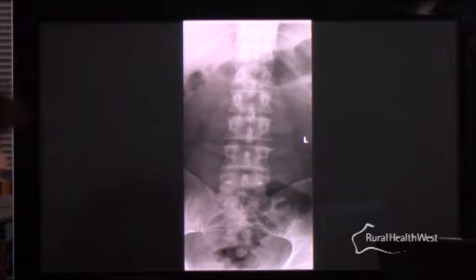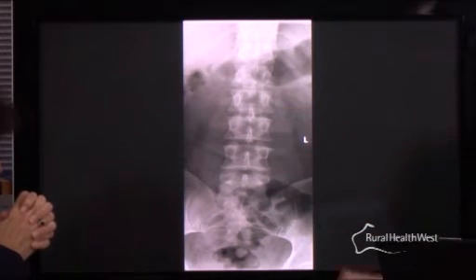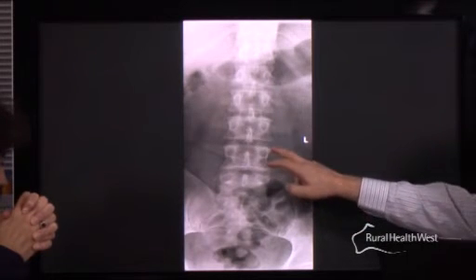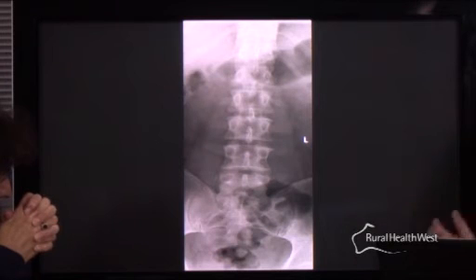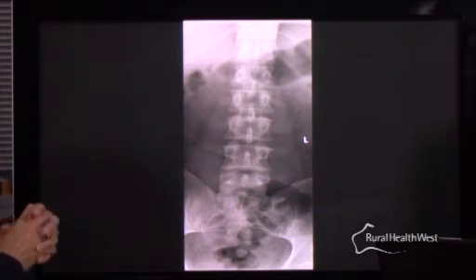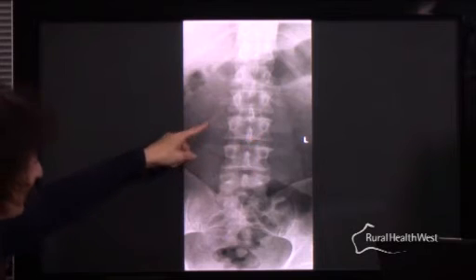Well, this patient was in a motor vehicle accident and had severe lumbar pain following it to the left of midline, and the patient came in looking for fractures. And the problem with looking at, for example, the lumbar spine is that you have all the bowel gas which is superimposed over the lumbar vertebrae and the posterior elements. And for example, there is a lucency running through there, but then you can say, well, maybe it goes off into the soft tissues and it's just a bit of bowel gas. You would probably pass that. Yeah, because there's another one here and another one there. And, you know, you would probably pass it.